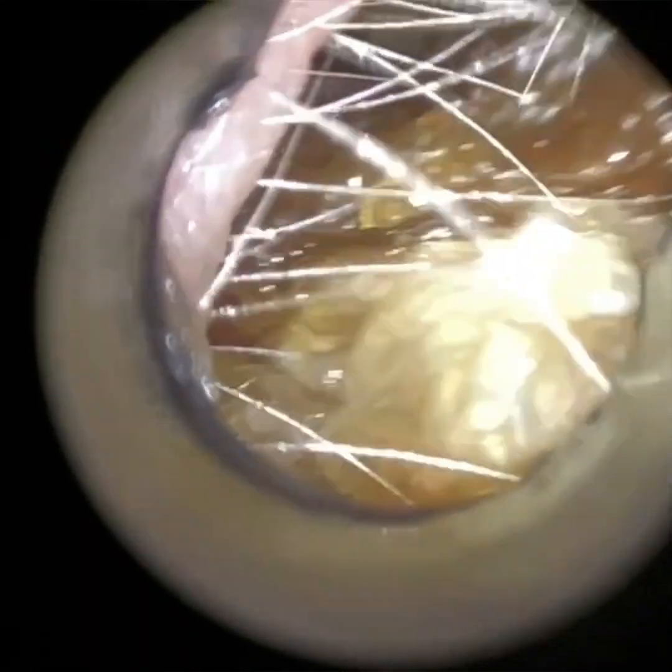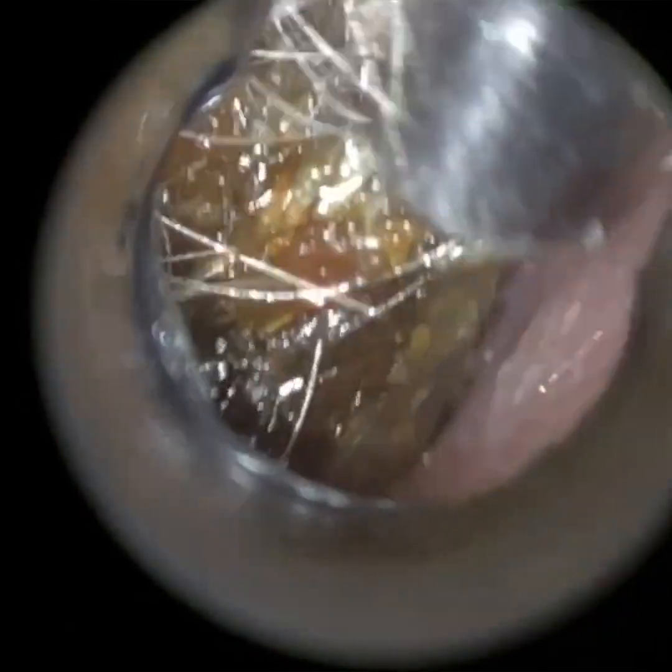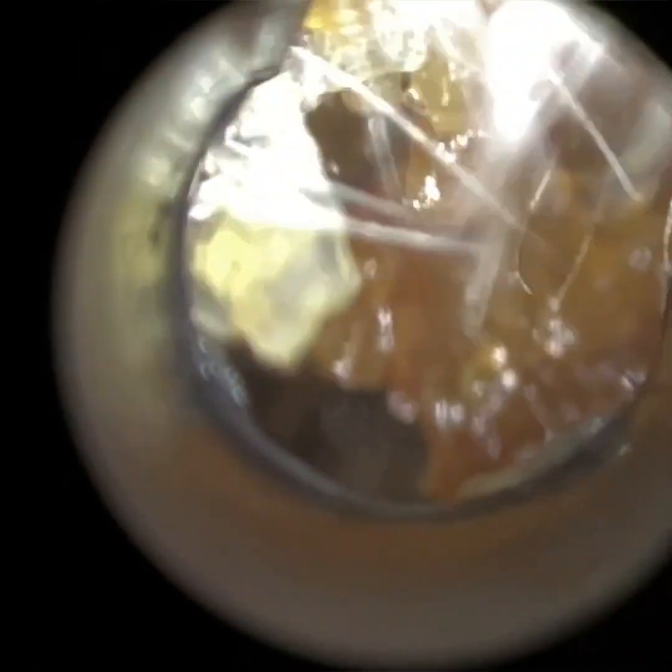We're near the end of the video. When I performed this procedure last year using the iClearscope, the procedure was about 16 and a half minutes. This one is a bit longer — I would say the complexity is probably quite similar, so it probably took me a couple of minutes longer with the Waxcope.